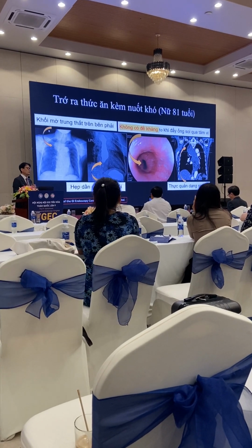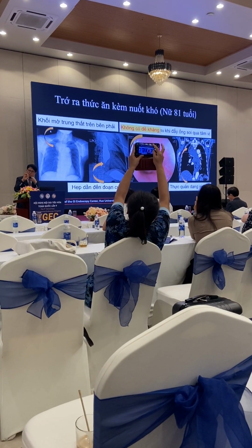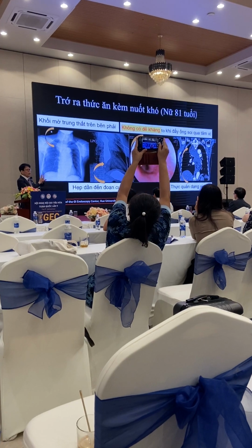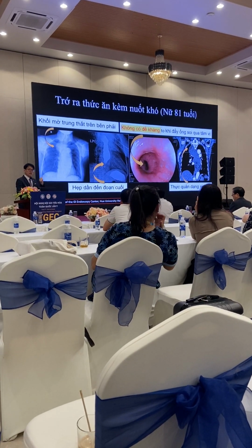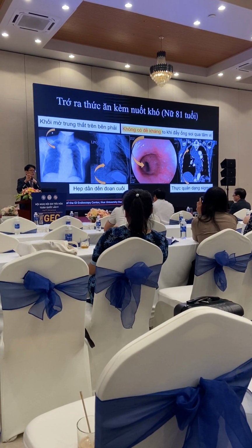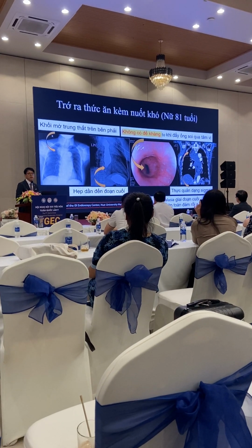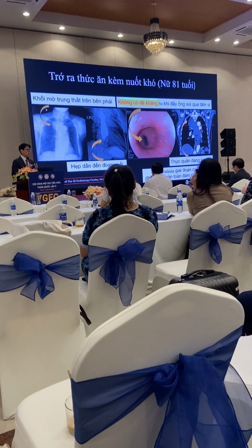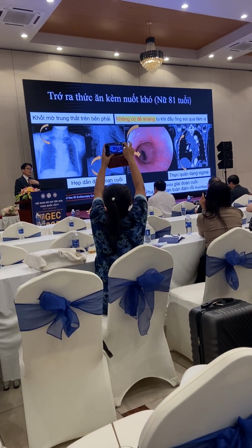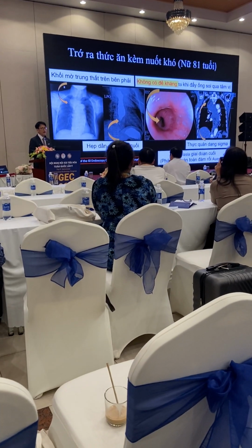We all know that when we do endoscopy it's very difficult, but we can see the pump at the tummy areas, because achalasia never allows endoscopes to go in. But in this case, it's very easy. So the endoscope goes through to the tummy very easily. Why? Because the Auerbach plexus has gone far. So from the tummy and then the upper esophagus, all motor function has gone. This is the late stage one.